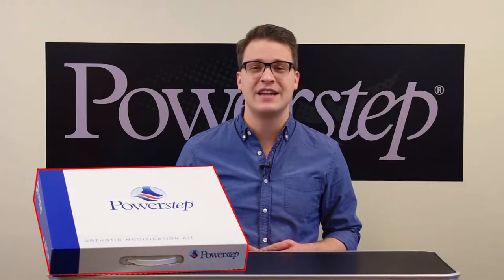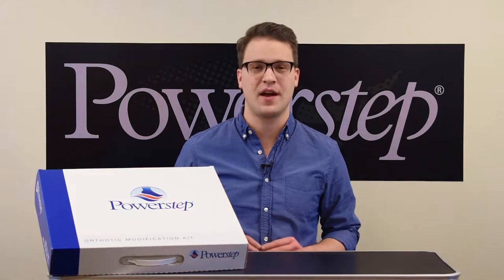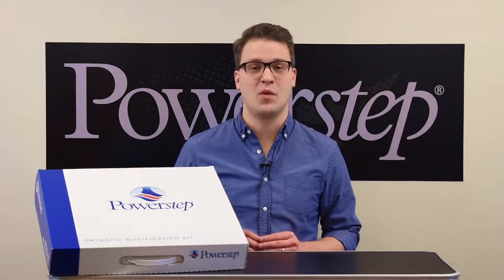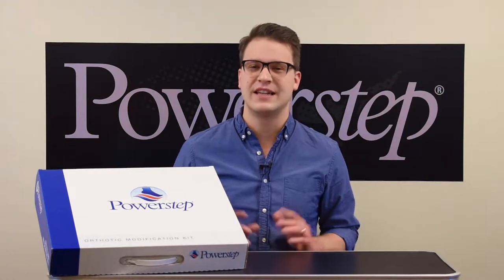PowerStep's new Orthotics Modification Kit is a great asset to help you provide more accommodation for any orthotic. With a variety of different wedges, lifts, and pads, you'll be able to address the most common orthotic needs. Let's take a look at how these components work and how to apply them.